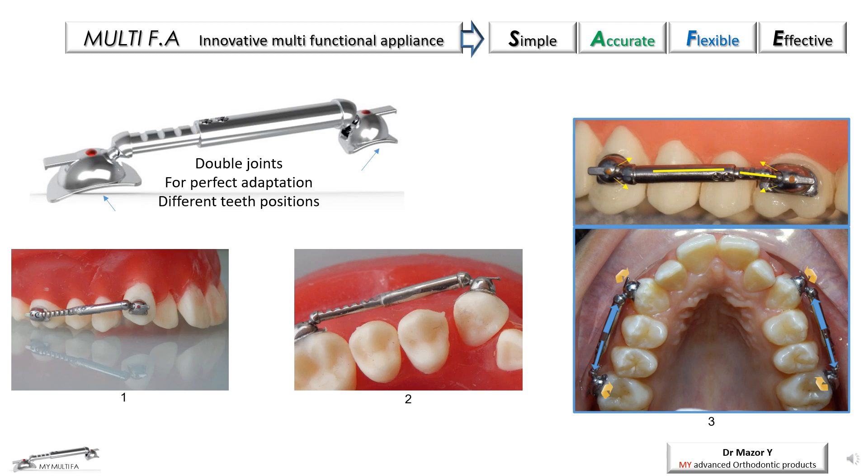The double joints also provide a biomechanical advantage, thanks to the dramatic decrease in side effects seen in conventional appliances, such as posterior cross-bite formation due to the rigid canine-premolar connector, which suffers a distal rotation under intermaxillary forces.